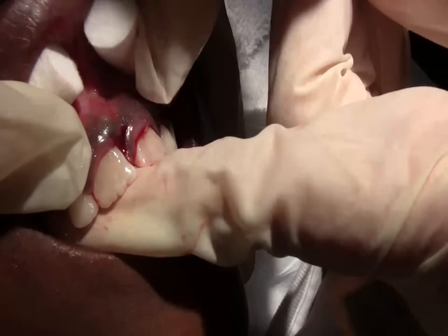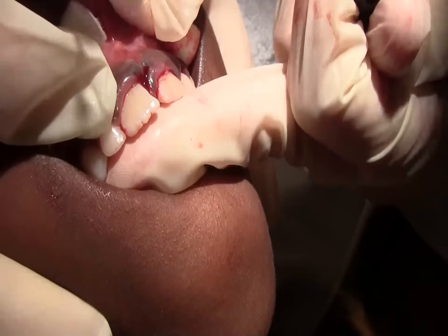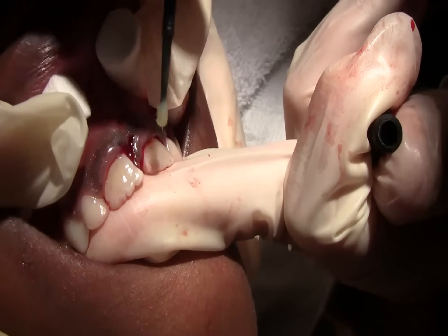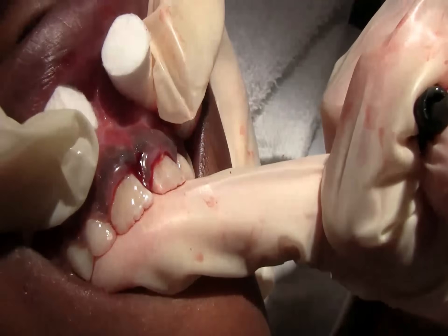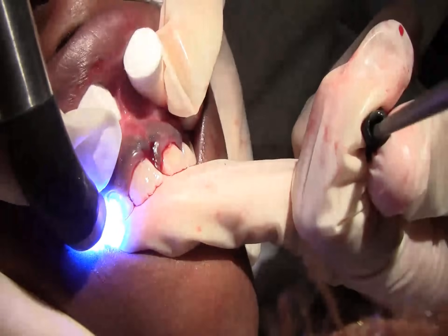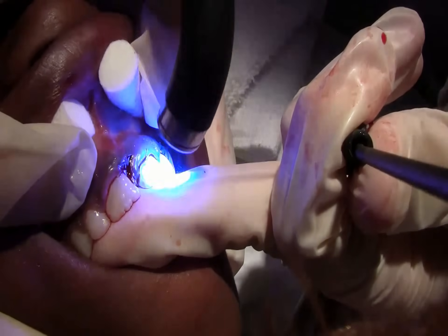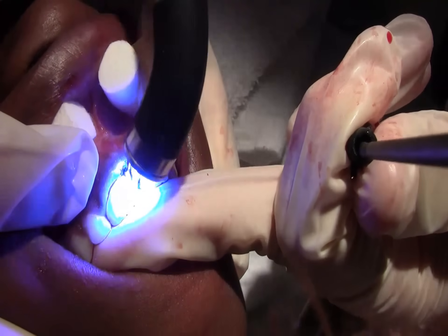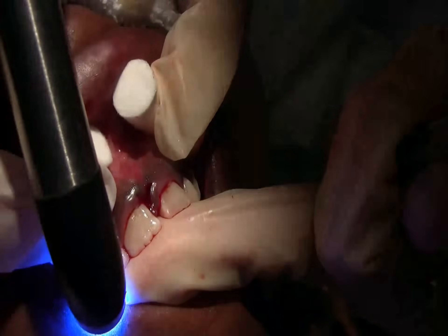This is where we're gonna use the curing light. Normally, you would want to acid etch this and rinse it off and dry, but we can't do that here. Open big, sweetie. It's just my fingers — you're just putting medicine on your teeth. That's all. No needle. Now we're just drying them. Sounds like a little hair dryer. You got your eyes closed? The little curing light stays on — about 15 seconds.